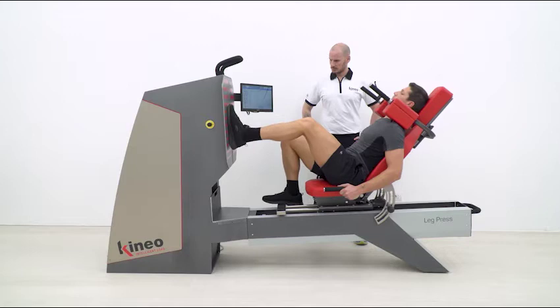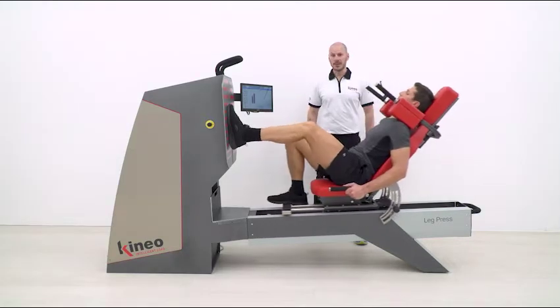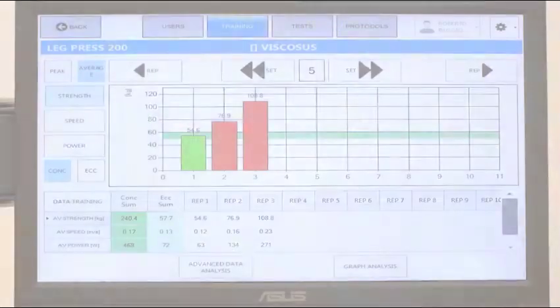Let's make 3 repetitions at increasing speeds: slow, medium and fast. We can see that with viscosity at 6, the loads are 54.6 kg in the first repetition, 76.9 kg in the second, and 108.8 kg in the third.